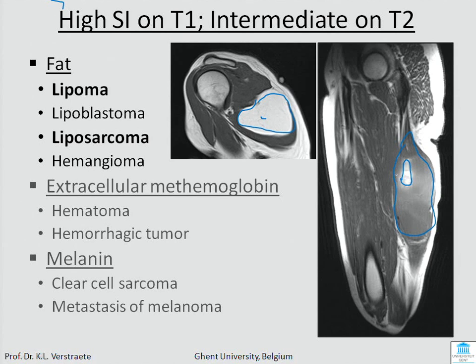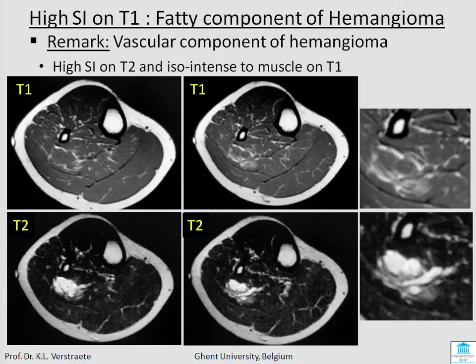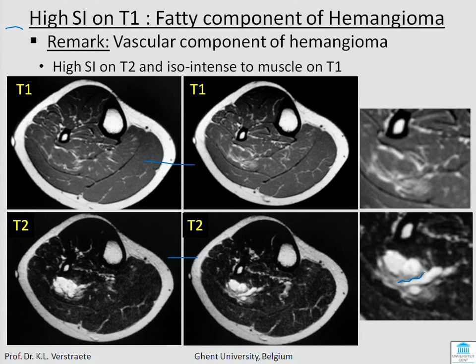Be careful: some malignant soft tissue tumors may bleed and methemoglobin can also cause high signal intensity on T1. Looking at this tumor — we have T1 and T2 images — when we look in detail we have serpiginous areas and also fatty areas. The combination of focal fatty areas with serpiginous areas that are high on T2 is a hemangioma. Many hemangiomas have the combination of fat and vessels.